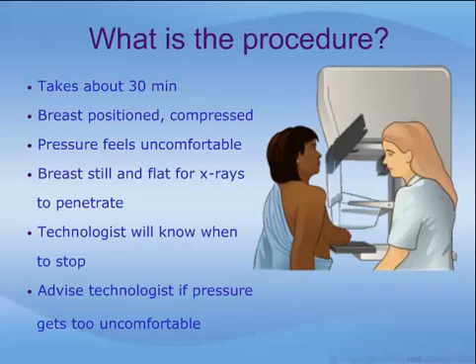An imaging technologist will first position and compress your breast between the 2 plastic plates on the mammogram machine. This pressure may feel uncomfortable, but it is necessary to hold the breast still and flatten it out so that X-ray beams can better penetrate the breast tissue. The technologist will know when to stop compressing your breast by feeling how tight the skin on the side of the breast is. But please, let the technologist know if the compression gets too uncomfortable.